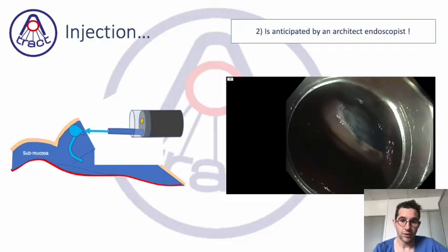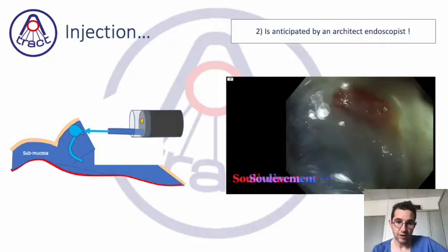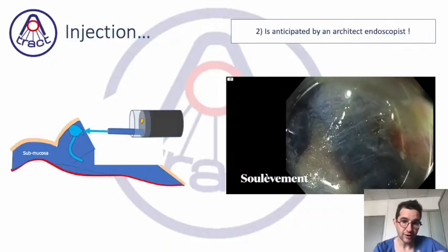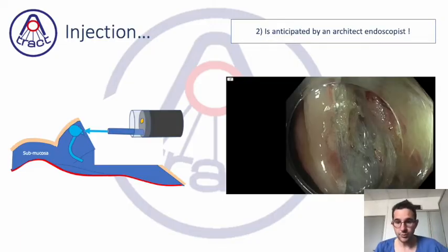We will go close to it. You have created an elevation. You have more water into the cap, so its weight is increased, and then therefore the gravity will help you. And by doing this rotation with the needle, you increase your elevation exactly like you want, and therefore you open the space.